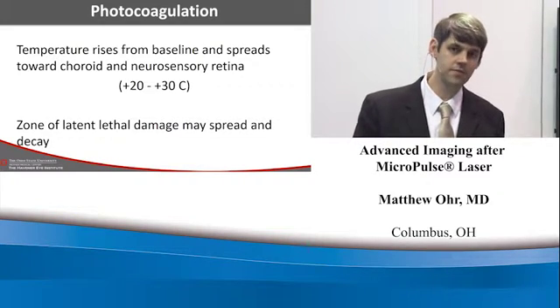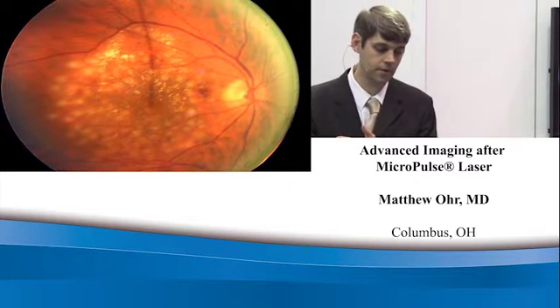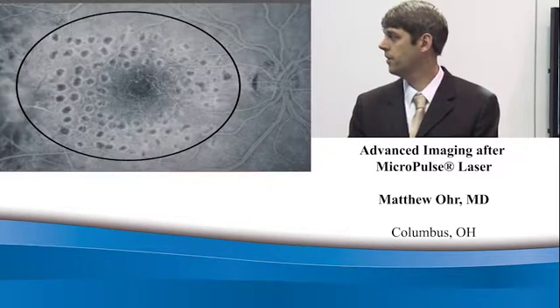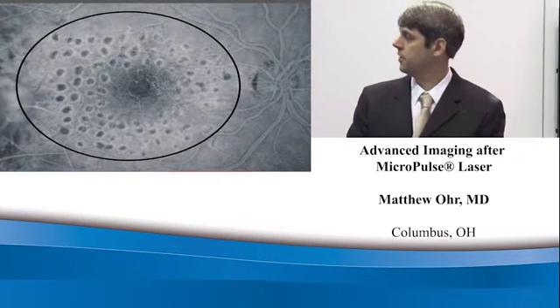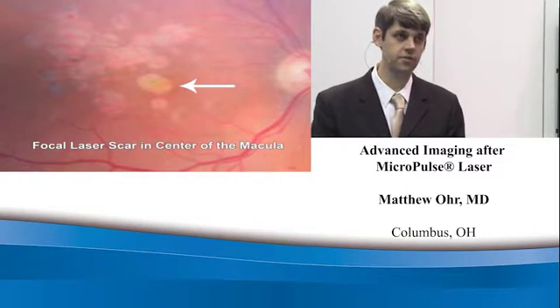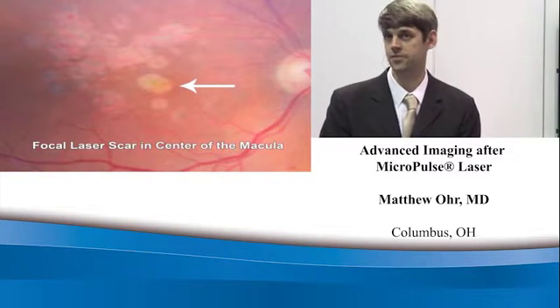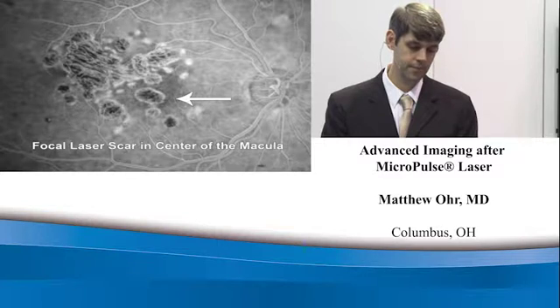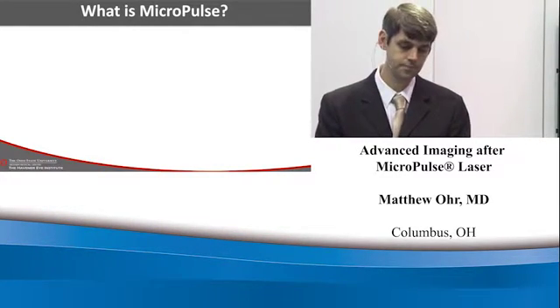And so when most of us think of focal laser historically, this is what we think about, okay? Focal laser with a visible endpoint. And we know that when you treat with focal, historically, this is what patients look like after treatment. Of course, this is the one thing none of us want to see, which is focal laser treatment that ends up in the center of the macula, which is always a concern with focal laser. And again, just other imaging that shows this damage that can occur.